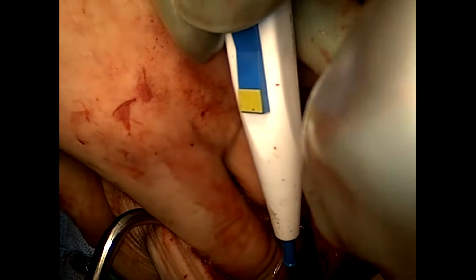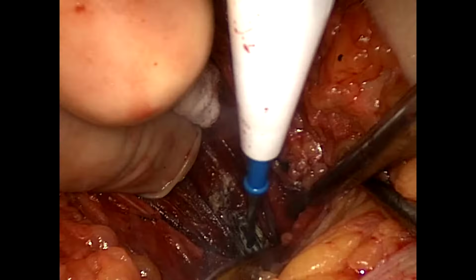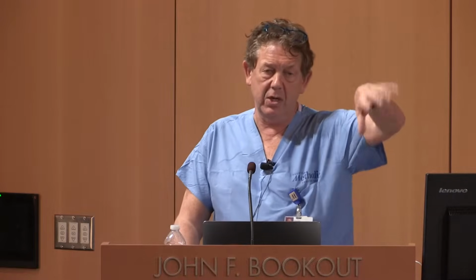And essentially, I think in this case, the bottom of the field is not very good, so let's start off from scratch. Typically, the groin is open. And so you're going from medial to lateral. What you're looking for is these muscle fibers. The muscle fibers run vertically, actually somewhat inferomedially towards the right side. What you're going to do is identify the muscle, take your Bovie, elevate the fascia from the front of the muscle to reach the lateral side of the muscle, and then you're going to go underneath the muscle.